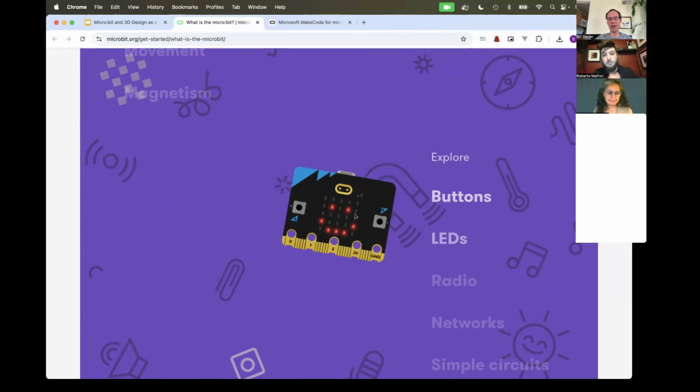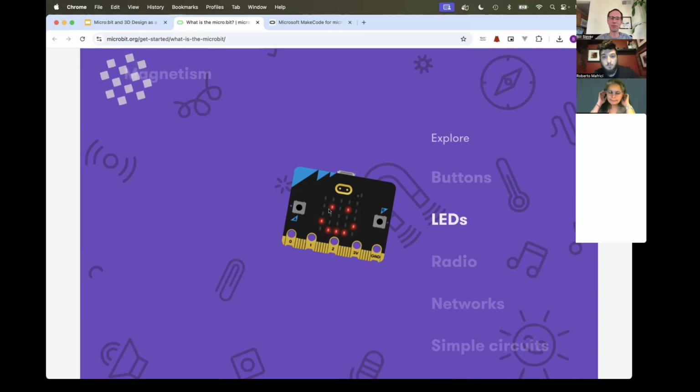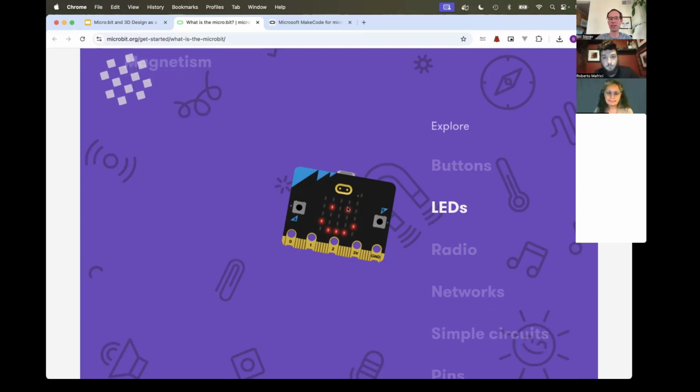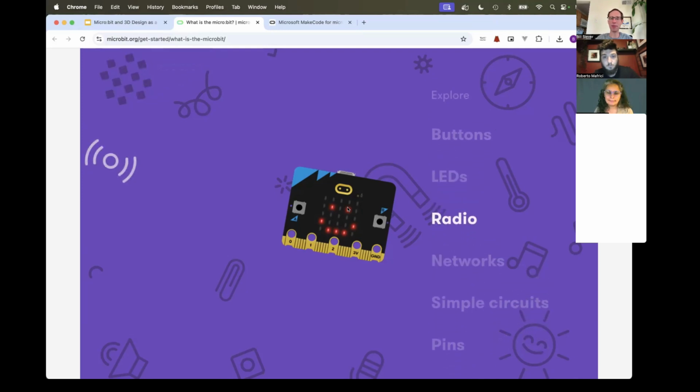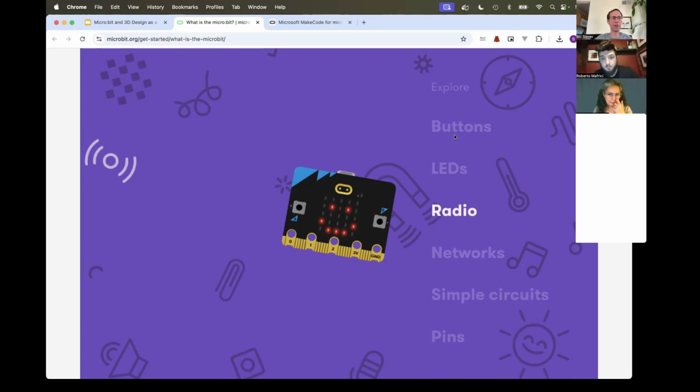So this graphic of the microbit has the two little buttons shown with these little square boxes, little clicky buttons, and that's the switch that our switch devices are actually going to utilize. It also has some LEDs built in, these little lights, which can be used to show its behavior. We'll include an example of those in our example demo program too. And then one of the really important ones for us is it's got a radio built in, and that radio allows it to talk to devices that have Bluetooth capability, like almost any modern computer or cell phone or tablet. So it's really the combination of having some buttons and being able to speak Bluetooth that enables what we're going to be doing today.